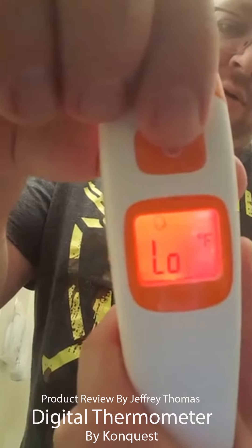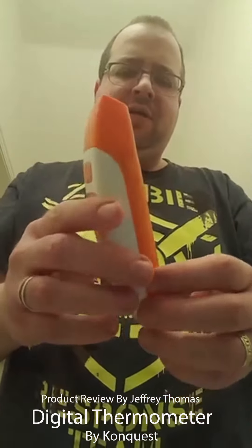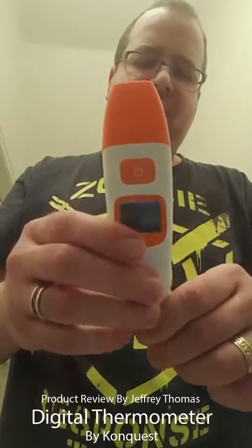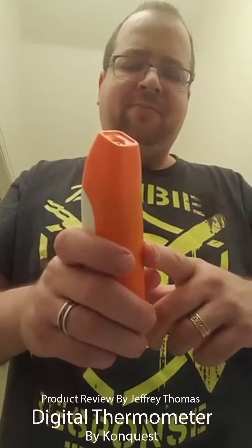Here is the LCD display — you can see it's a very good quality unit. This will work really well for my daughter; she hates things around her ears, so I like that I can even take her temperature while she's sleeping. It gives accurate readouts — I've tested it against a glass thermometer underneath the tongue two or three different times, and every time it was accurate. This is made by a company called Conquest, so it's a good product.